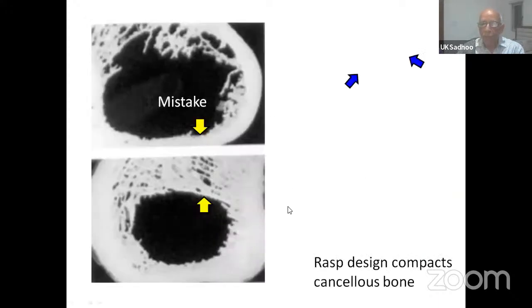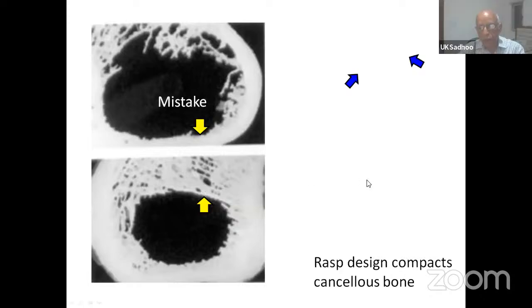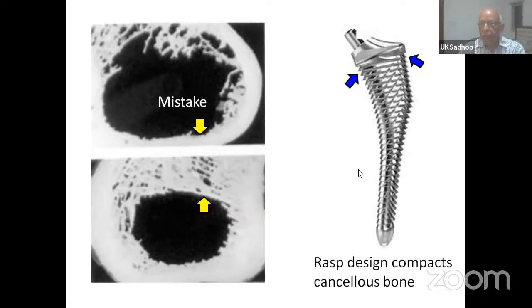Now, this is something that is undesirable. While reaming or preparing or rasping, we must not bare the bone down to the cortical bone, because what we have done is taken most of the good cancellous bone away from the bone into which our cement is going to interdigitate. So even the rasp is made in such a way, look at these sharp teeth angling down.